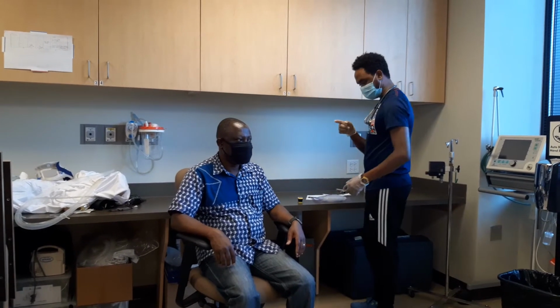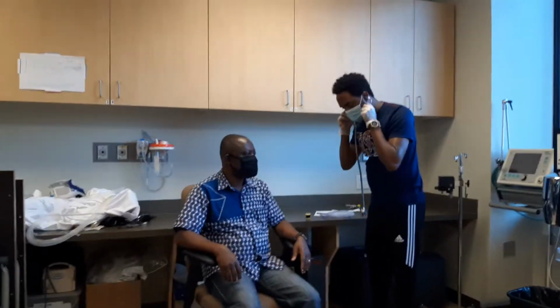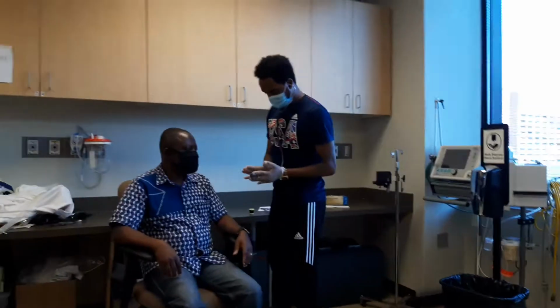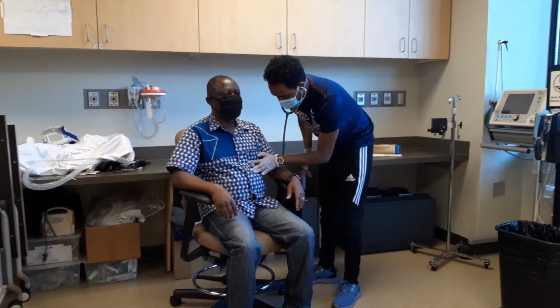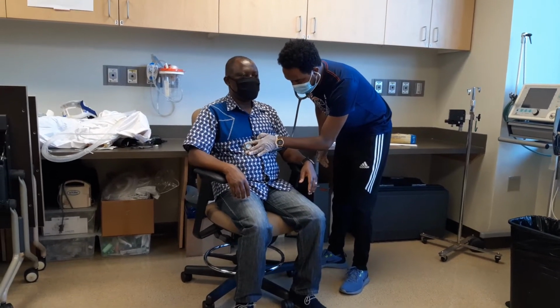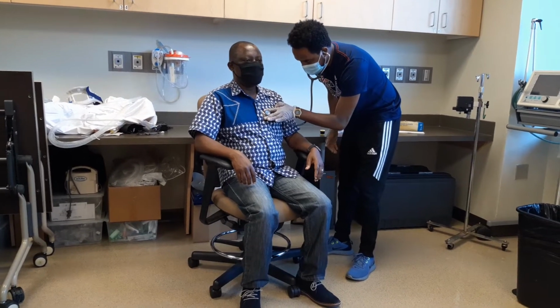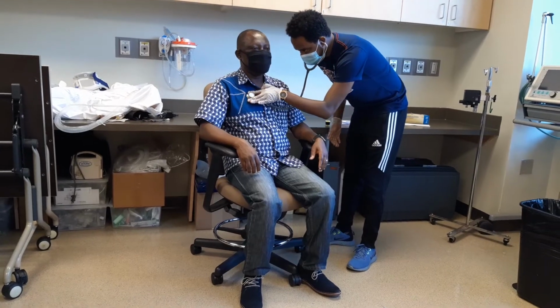Okay, I'm going to check your lung sounds. Deep breathing. Deep breathe in and out.